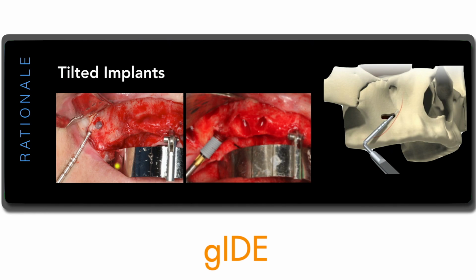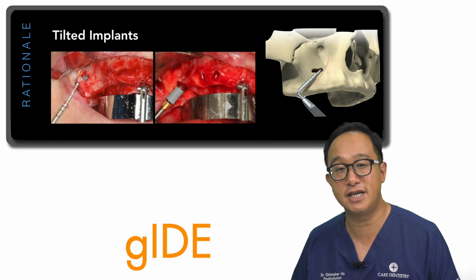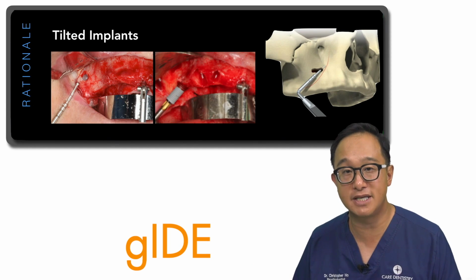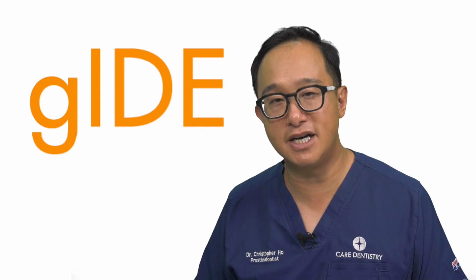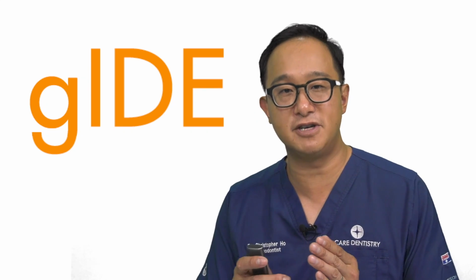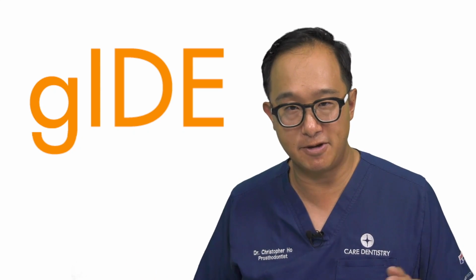In this image, you'll see that a window is made in the sinus, so we can locate where the sinus is, and we're going to then place our implants anterior to that wall. And these are angled 45 degrees as a maximum, so anywhere from 30 to 45 degrees. And by angling these implants, one, you're placing a longer implant. Secondly, you're engaging bone more anteriorly, which has better quality bone than the posterior maxilla. And then also by angling your implant distally, you're minimizing the cantilever forces because you're increasing the AP spread. Your implant being placed more distally increases that AP spread.